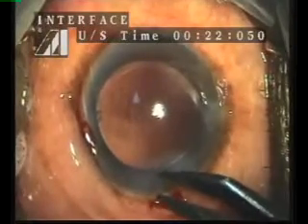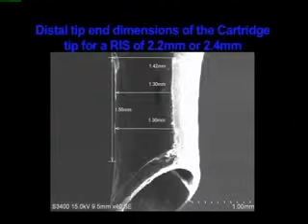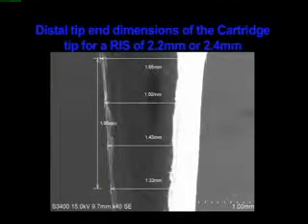At least 2 mm or slightly more chord length of a clear corneal valve architecture will be required to obtain a better and faster sealing wound. Dimensions of microincisional lens cartridges were measured with a captured image in the scanning electron microscope in order to analyze the internal diameter, external diameter, and the measurements pertaining to its tapered tip.